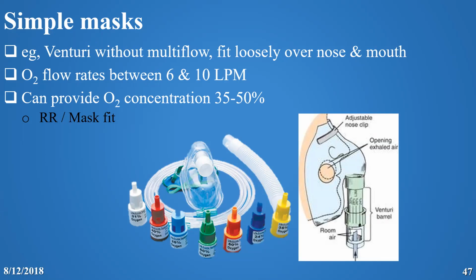I have just a question. In the Venturi mask, the air in the room will also enter with the oxygen? The Venturi is talking about this area that connects the mask to the oxygen source, and then you can dial. So once you change the flow, you change the concentration of the oxygen.